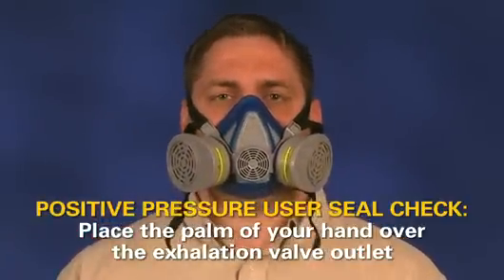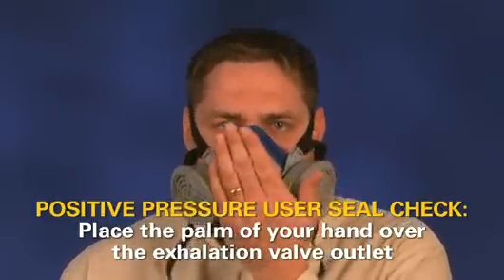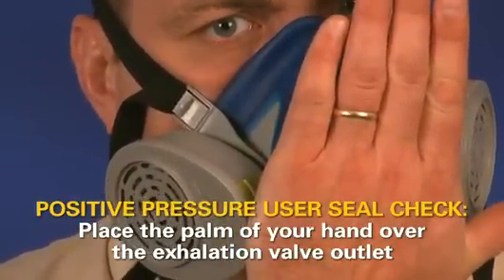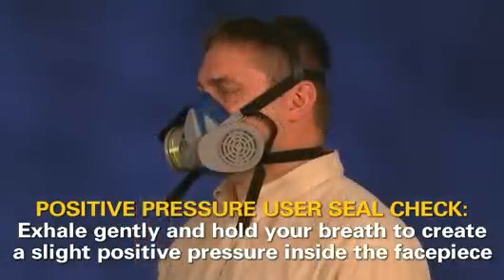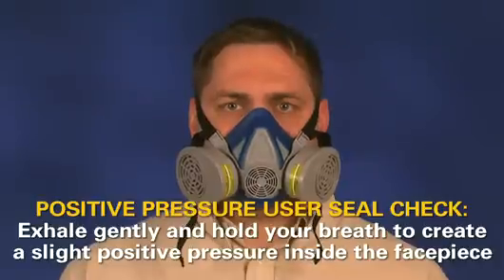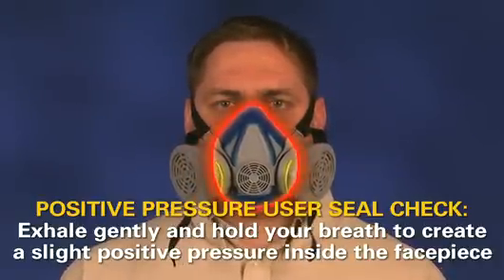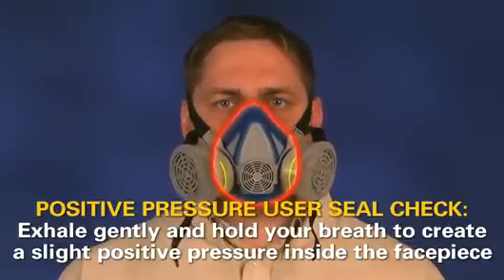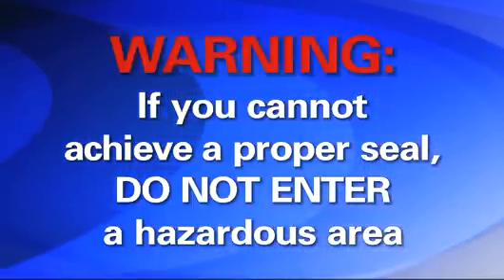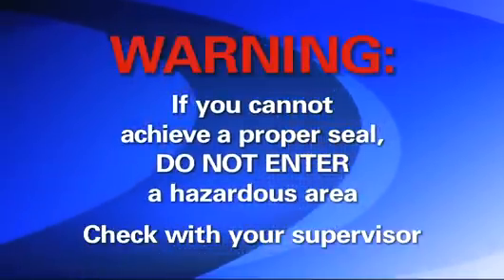Perform a positive pressure user seal check. Place the palm of your hand over the exhalation valve outlet. Do not push so hard that you distort the natural shape of the face piece. Exhale gently and hold your breath to create and maintain a slight positive pressure inside the face piece. If the face piece bulges slightly and no air leaks are detected between your face and the face piece, a proper fit has been achieved. If you detect a face seal leakage, reposition the face piece and readjust the straps, then retest. If you cannot achieve a proper seal, you are not protected and should not enter a hazardous area. See your supervisor to determine what the problem may be.